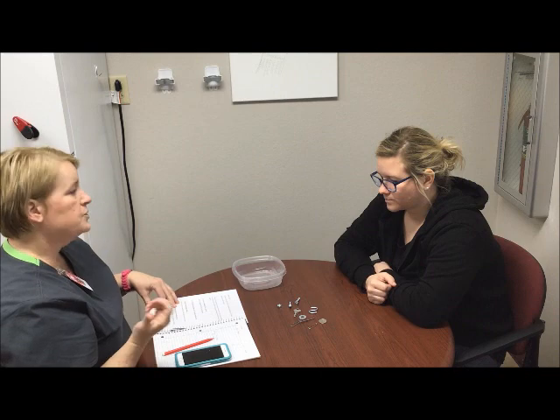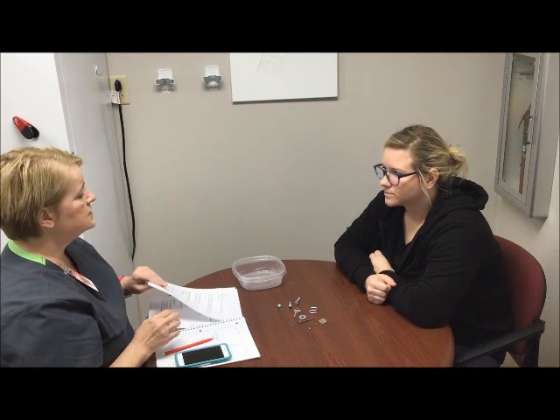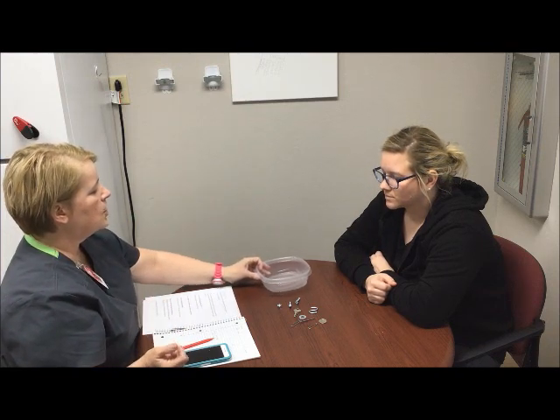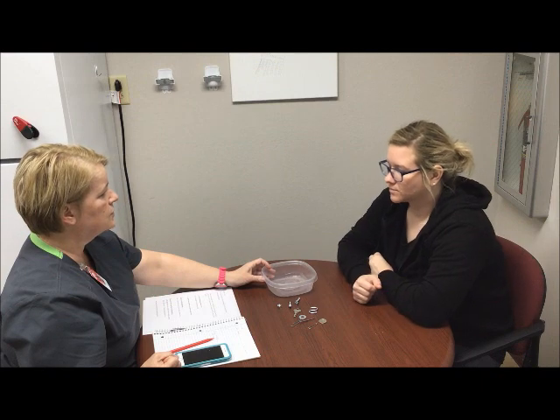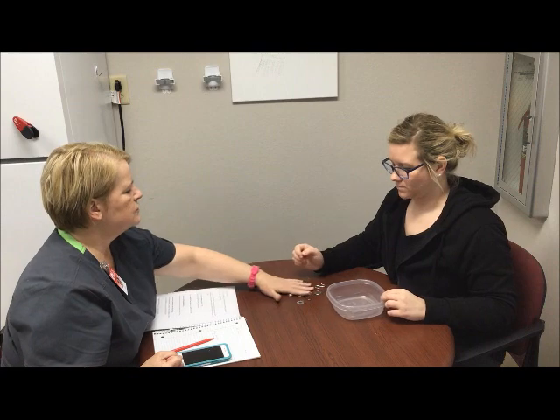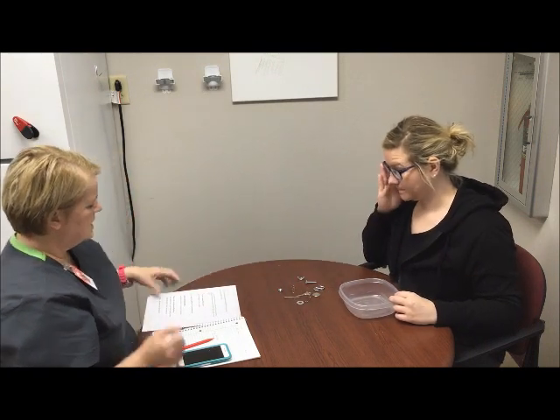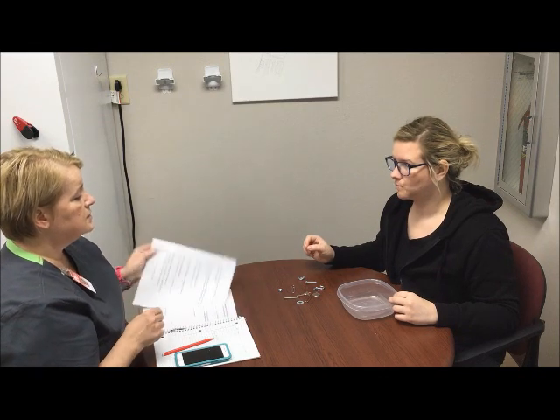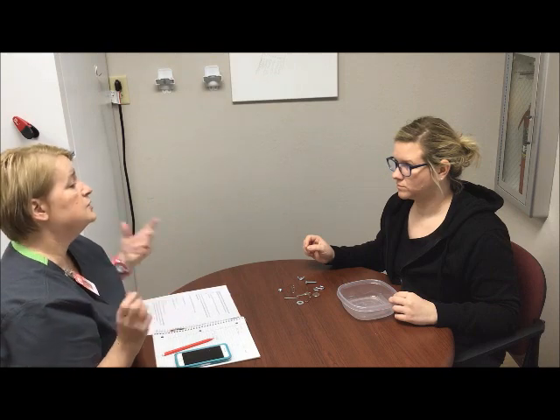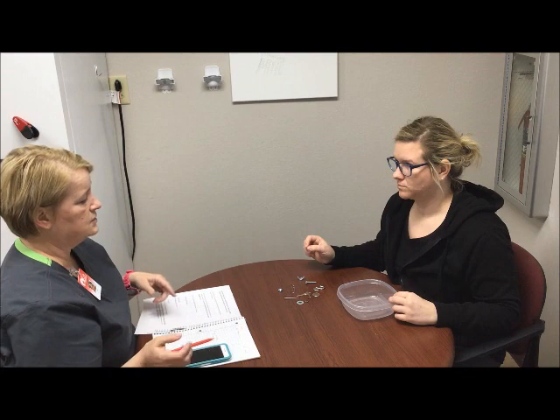What we're going to do is start with your right hand first. You're going to pick up these items as quickly as you can while holding the container with your left hand. We'll spread them out so you can get them easily, and you'll put them in the container as quickly as possible while I time you. We're going to do each hand three times.